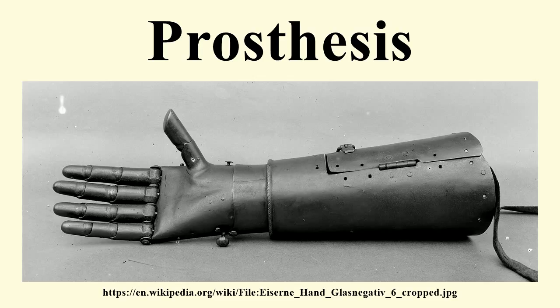The advancement was due to the difference in the socket-to-patient contact model. Prior to this, sockets were made in a square shape with no specialized containment for muscular tissue. New designs thus helped to lock in the bony anatomy, locking it into place and distributing the weight evenly over the existing limb as well as the musculature of the patient. Ischial containment is well known and used today by many prosthetists to help in patient care. Variations of the ischial containment socket thus exist, and each socket is tailored to the specific needs of the patient.